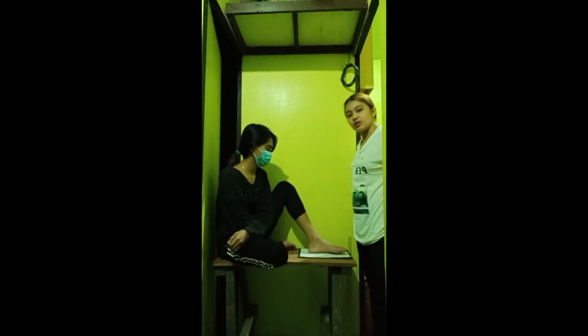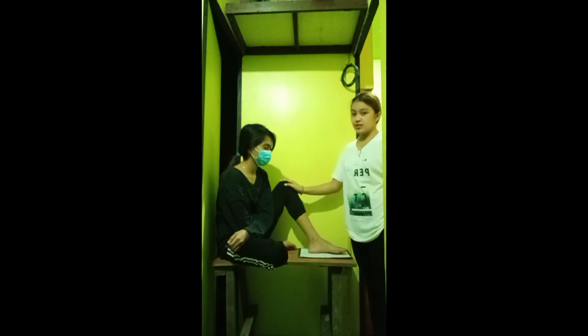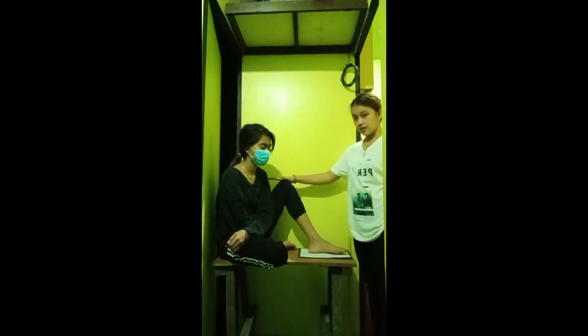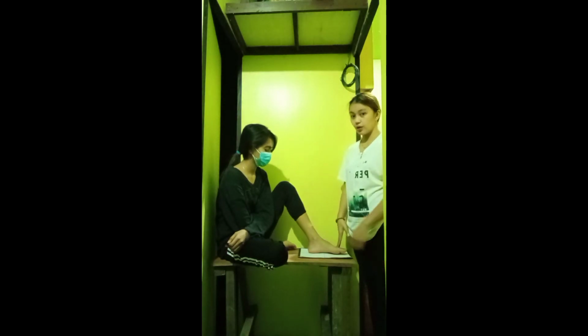The next projection of the foot is the AP oblique lateromedial projection, wherein the patient is still seated comfortably at the dummy radiographic table. The knee is still flexed and the foot is still in contact with the IR.